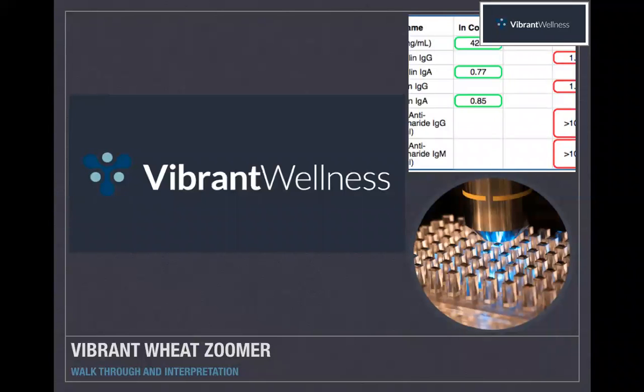Thank you for your interest in the Vibrant Wellness Wheat Zoomer. This video is designed to help you quickly interpret a Wheat Zoomer lab report. Look for further follow-up videos that will go further in depth into the individual panels on the Wheat Zoomer for more advanced interpretation.